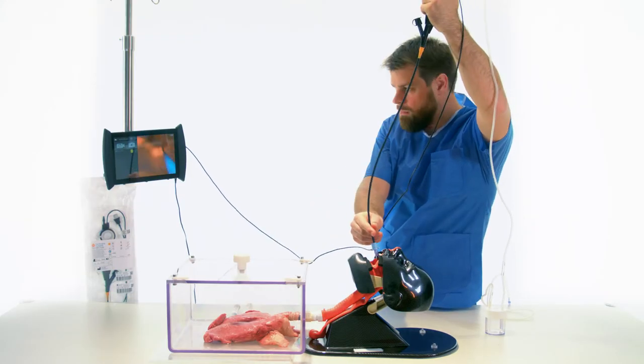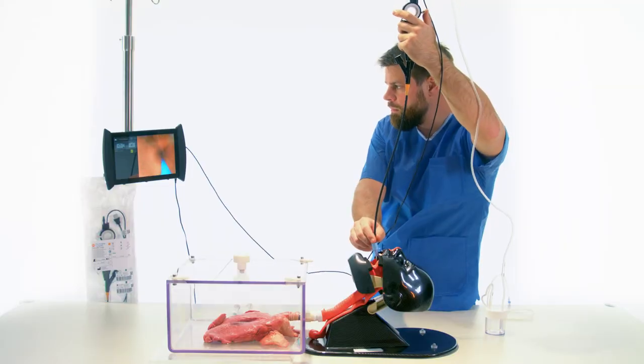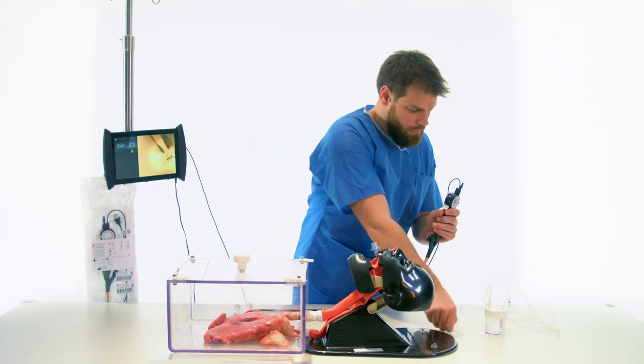A BroncoAlveolar Lavage is performed to obtain a sample of cells and proteins for culture and analysis. A specimen trap is connected to the BroncoFlex, which is attached to the suction line.